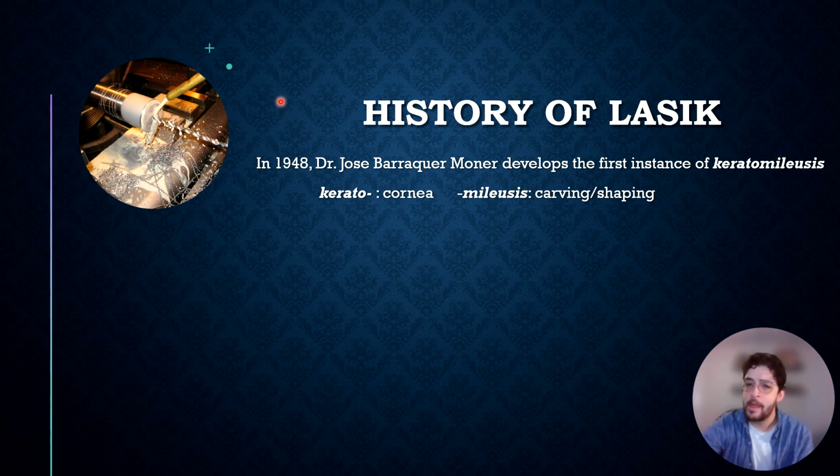And you're probably thinking, that's pretty barbaric to cut off the front of someone's eye and carve it down on a lathe. But it actually worked pretty well. After this, the patient saw pretty well. There were very minimal complications from it. And so that ended up paving the way for a whole myriad of different refractive eye surgeries after that.